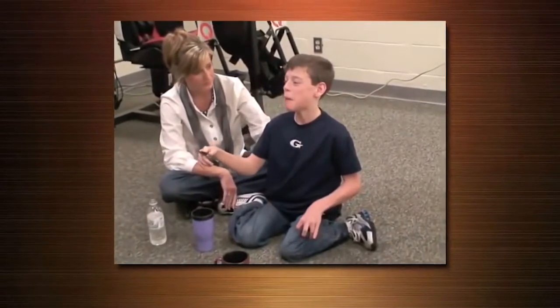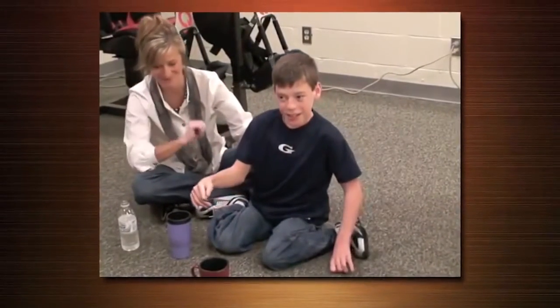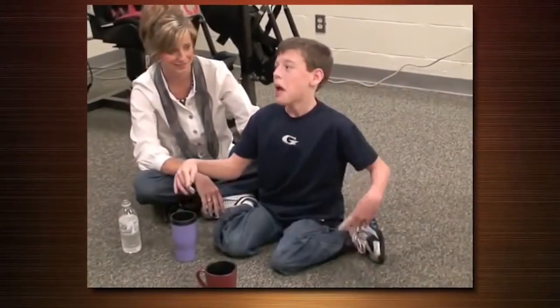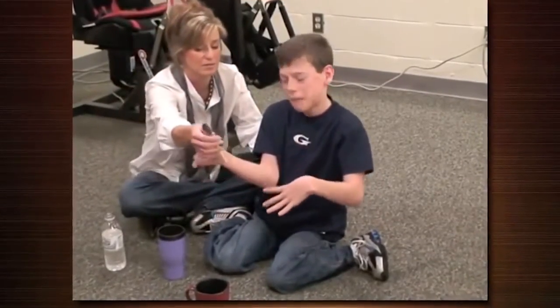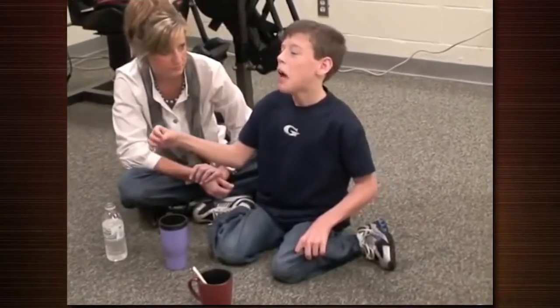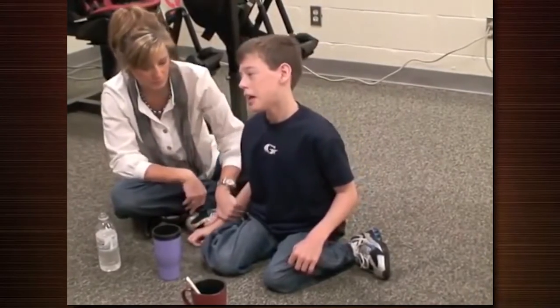I've never been able to raise my hands up that high. It's an emotional thing. I've never been able to cross them like that — that's the first time I've ever done that. When I walk, I don't normally stand like this. Let's try it again. Yeah, okay, let's do that.